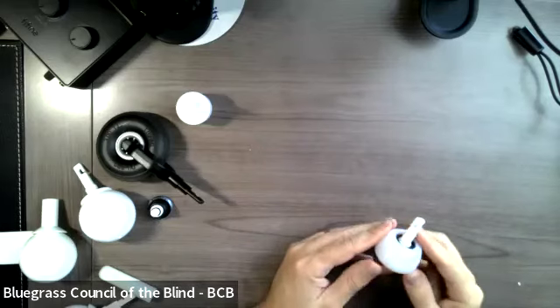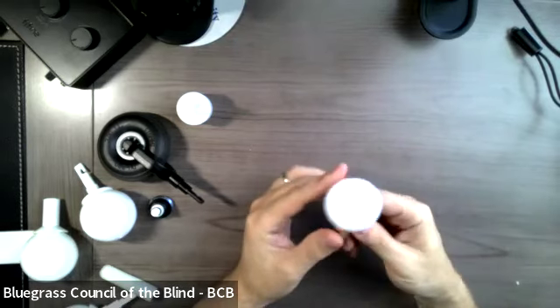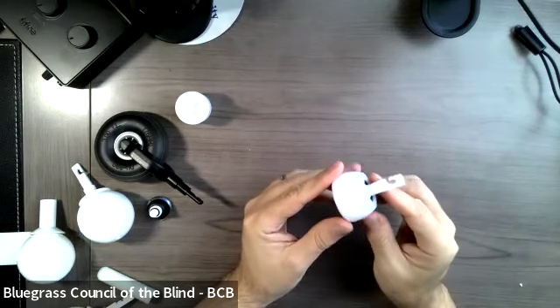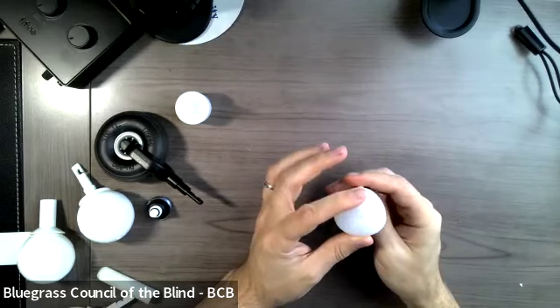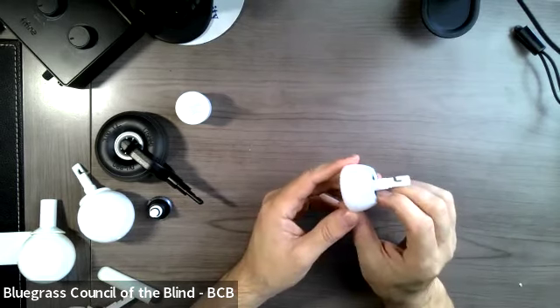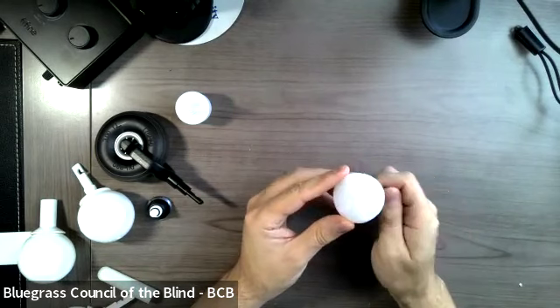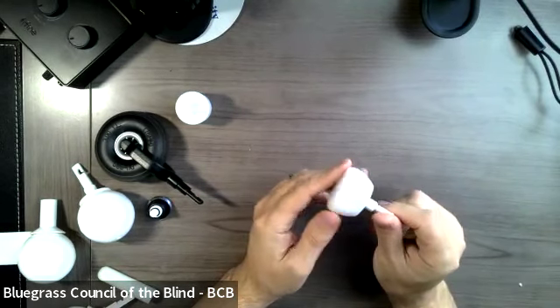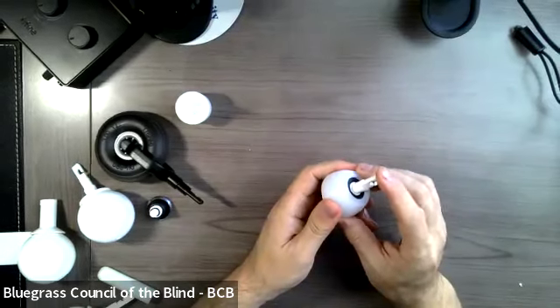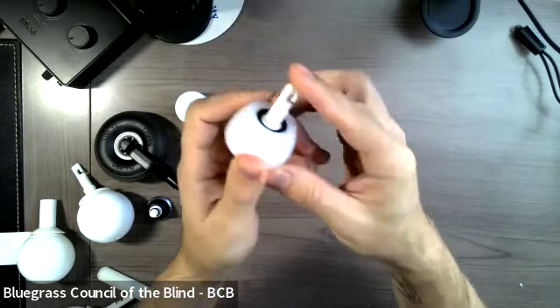And then one of the last tips I want to talk about is the flex tip. It's very similar to the jumbo roller. It is a little bit smaller. It's only about an inch and a half, 2 inches wide, and maybe about an inch thick. Kind of like a little hockey puck on the end of your cane. But the stem here that connects to the cane flexes. So I'll see if I can do that, and you guys can see it here. Where's my camera? There it is.